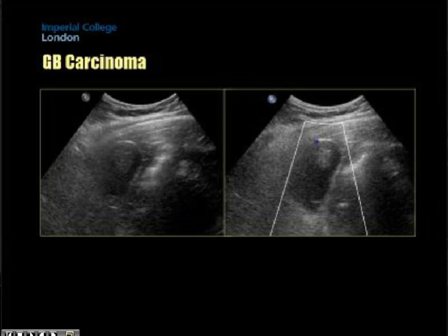Color Doppler is not going to help you, as you can see from this video. You may just see one of the vessels, but I think this is probably an artifact. You don't really see any of the vascularity that easily on color Doppler ultrasound. With contrast, it's much easier.